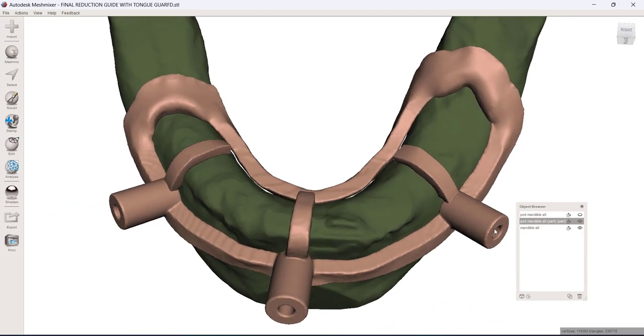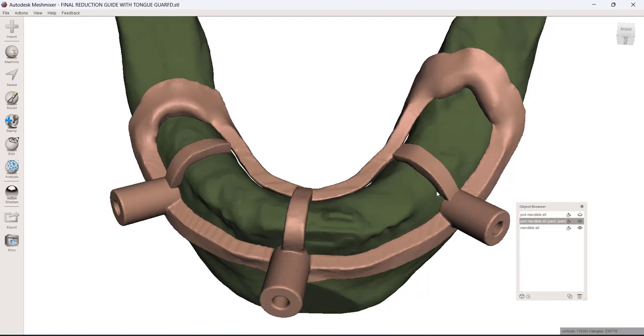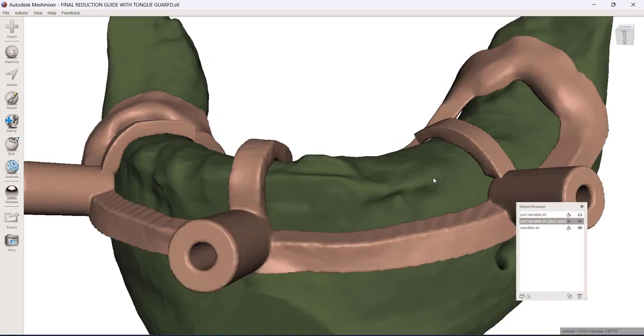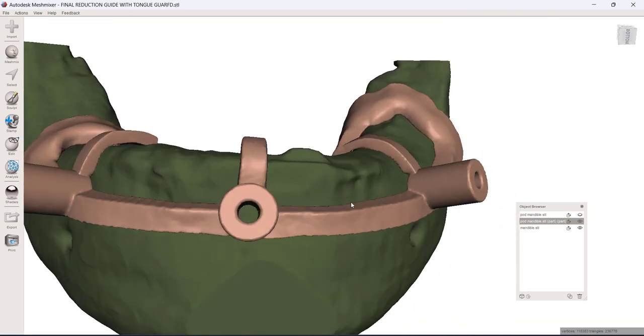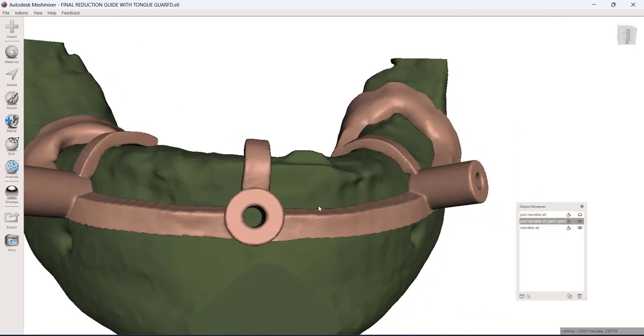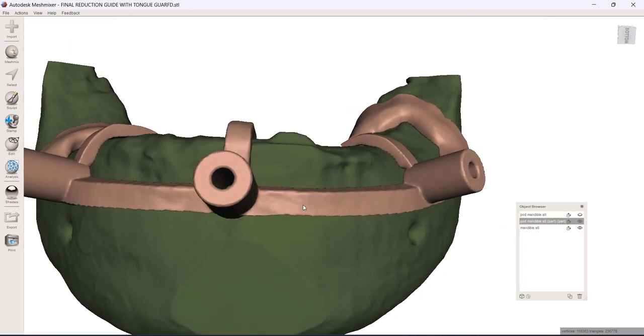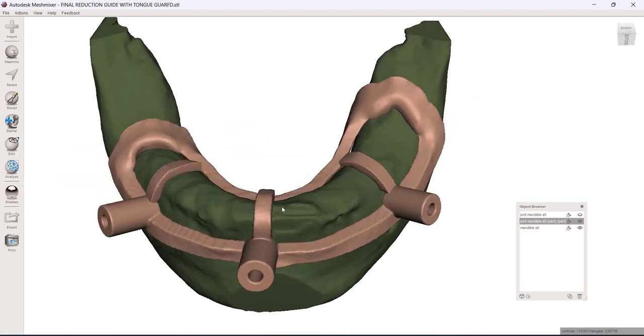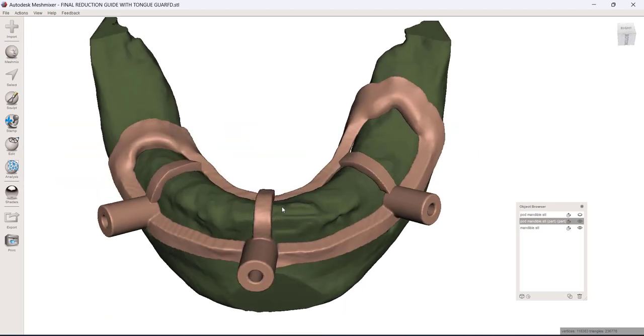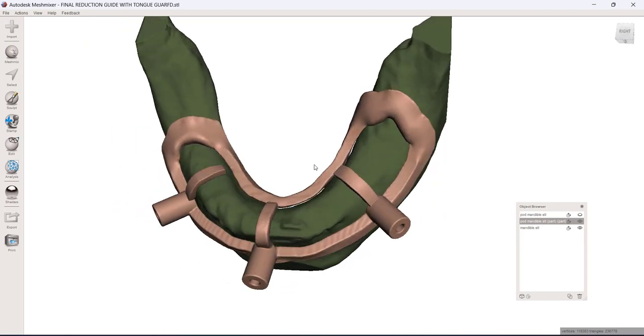And once it's down in position, you can drill the pin holes, insert your pins. And once all three pins are in, you can go ahead and start reduction. And once you do start the reduction, you just basically buzz right through these little stops. Those fall away. And then you can just bring your reduction down to the level of the reduction guide. So that's just to make sense of what you're seeing in this case.